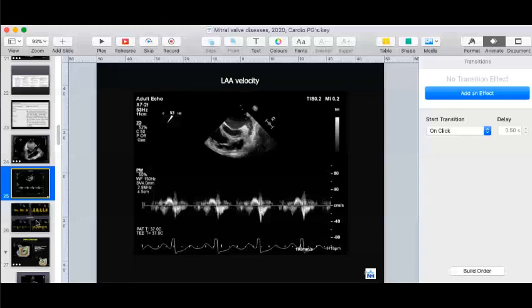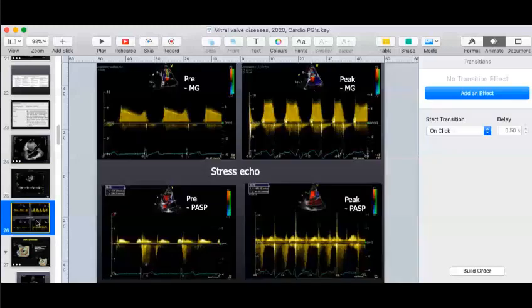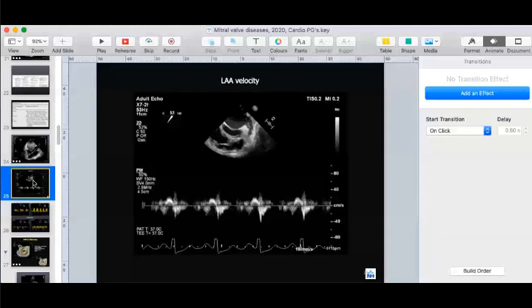Right. Now, tell me the role of... Sorry? Yeah, okay, tell me. Two waves in the filling, no, sir? Yeah, the early and the late filling is there, but generally focus on the early part. This is the filling. But primarily, our focus always has been the emptying velocity here.